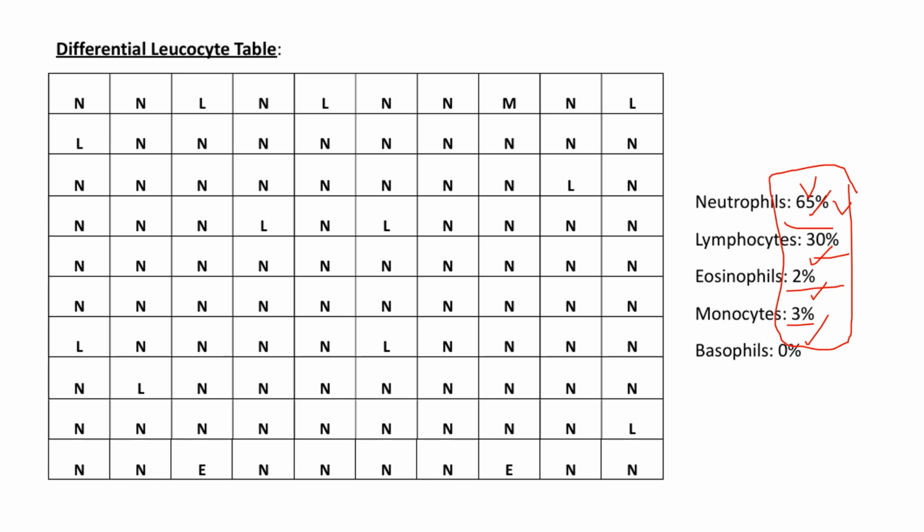So sometimes you can fake it, but if you fake it, it has to be better that you do it in the exam. So when you count everything, it has to be 100. Please make sure that when you draw this box and count it, you get 100 cells, because this box is a 10 by 10 box which contains 100 boxes eventually.